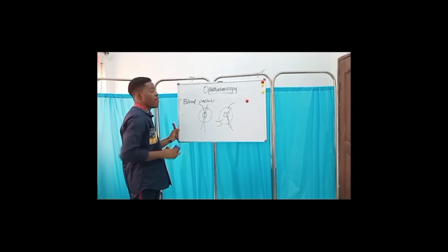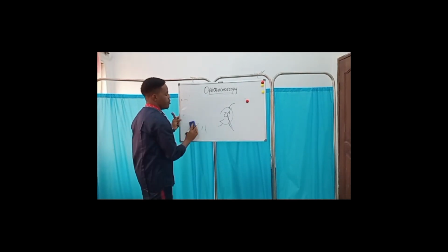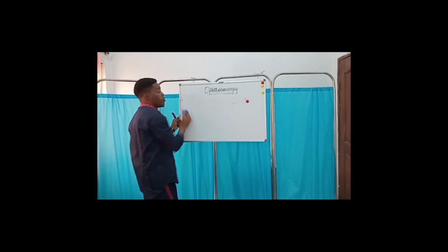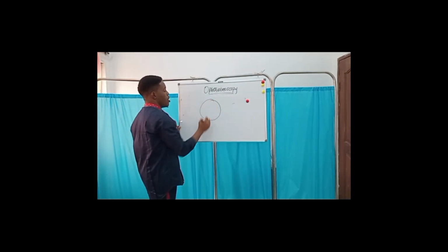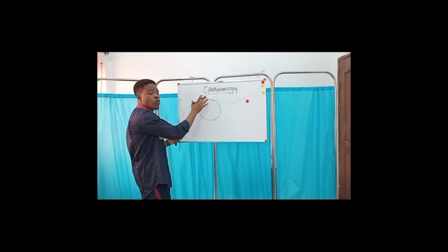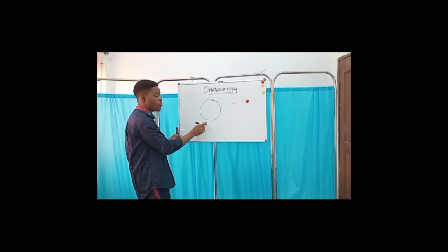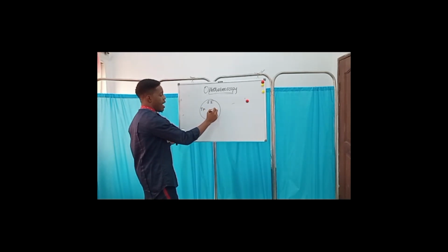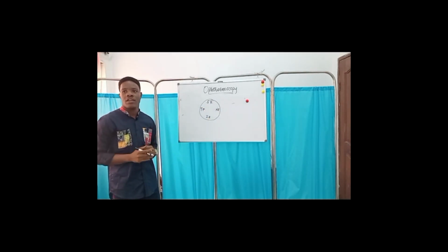After we've done evaluating the blood vessels, we want to now look at the fundal background, the fundus. So at the fundal background, we are looking at the superior fundus. We want to make sure the superior fundus is clear. We will look at the inferior fundus. This is the inferior fundus, superior fundus, and this is the temporal fundus, and then the nasal fundus. We want to examine all of them and make sure that there's nothing going on there.